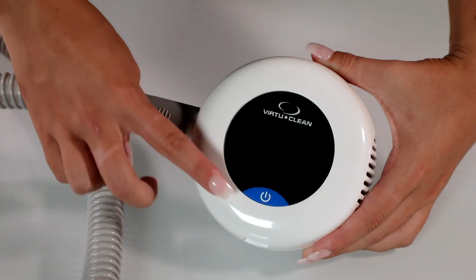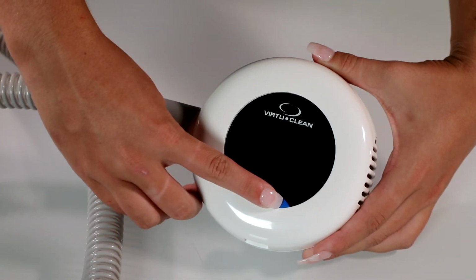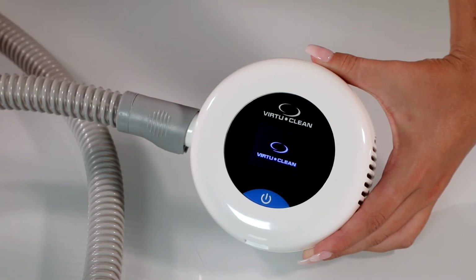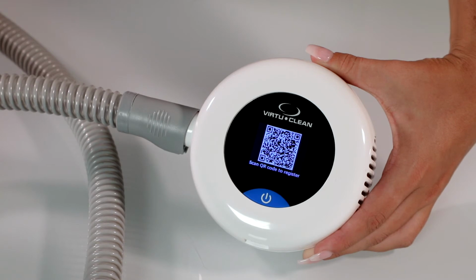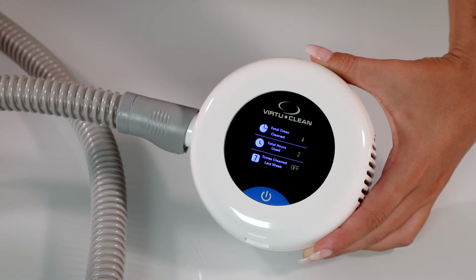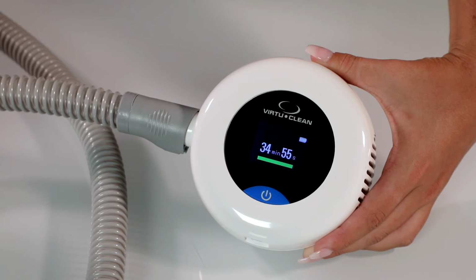Press and hold the blue power button for a few seconds until the VirtuClean 2.0 logo appears and the device turns on. Allow the device to rotate through the next few screens. Your VirtuClean usage data will display, including total times cleaned, total hours used, and the number of times cleaned in the last 7 days. After approximately 5 seconds, the VirtuClean will automatically begin its cleaning cycle and the screen will display a countdown timer while the cleaning cycle is running.